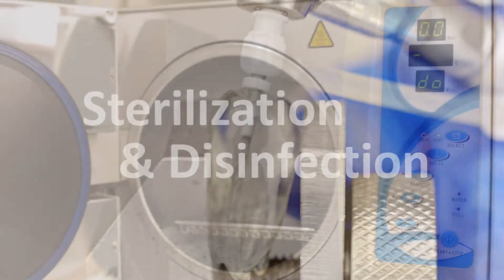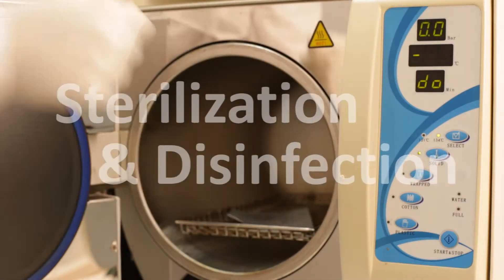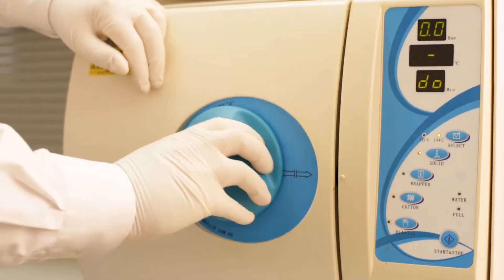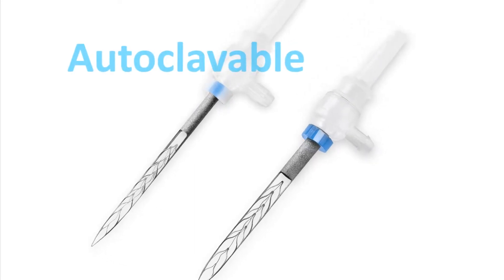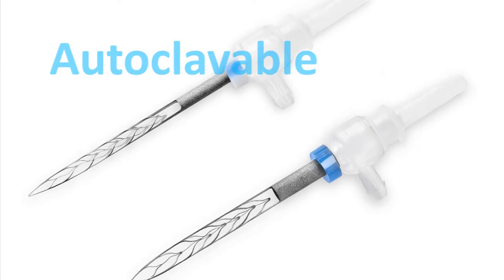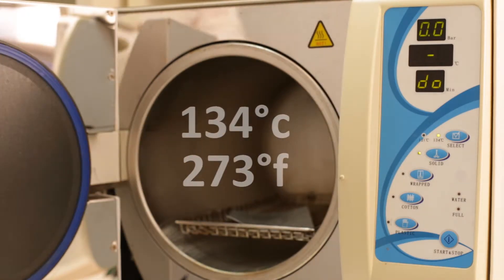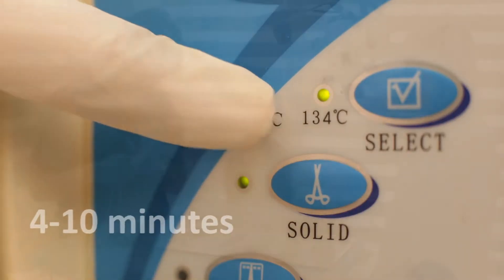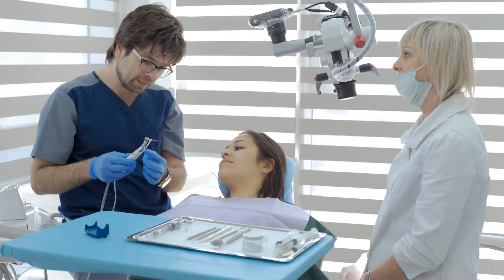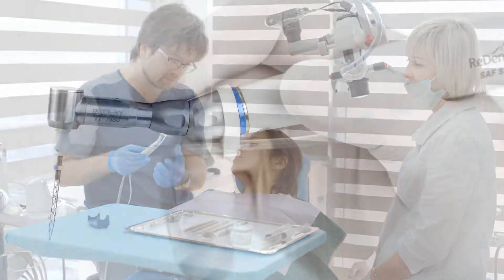Standard means of infection control should be kept when using the SAF system, as in all endodontic equipment. The self-adjusting files are supplied in non-sterile blister packages and should be autoclaved prior to use. Use a calibrated autoclave at a temperature of 134 degrees Celsius or 273 degrees Fahrenheit between 4 and 10 minutes. Using a higher temperature setting may result in damage to the plastic shank of the SAF.